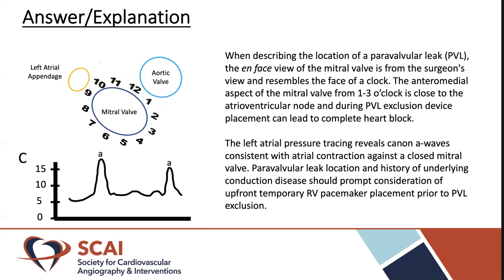So the correct answer in this case was option C, in which we see Cannon A waves, and this is potentially related to complete heart block, where the atrial contraction is occurring against a closed mitral valve.